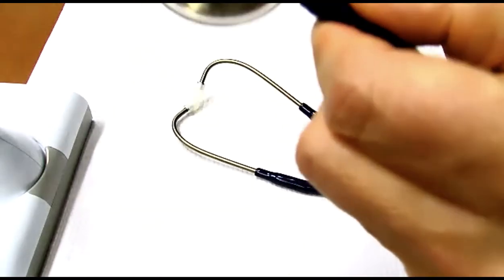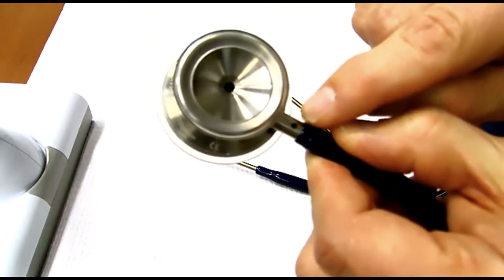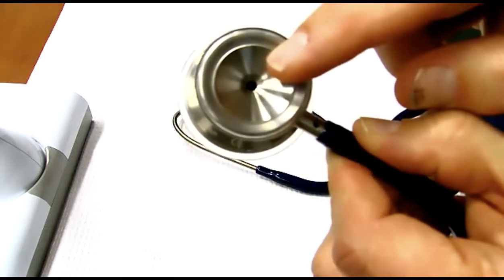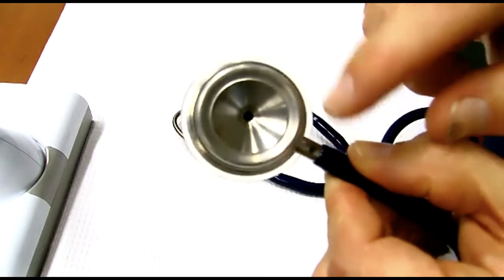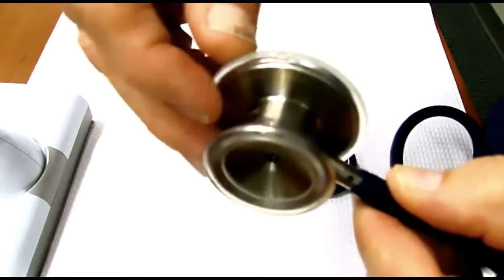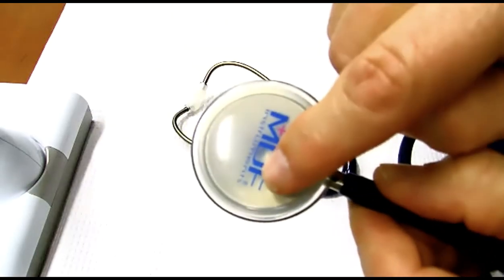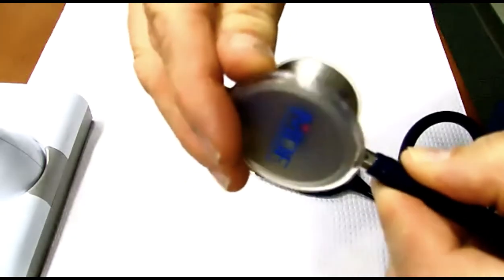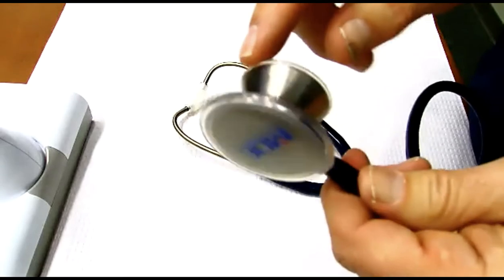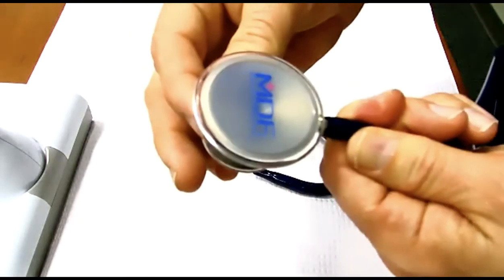Turn it around, look at your stethoscope until you can see a dot. There should be one; mine's a green dot right here. The green dot on the base lines up with whatever side is active. So since my green dot is right here, that means the bell is active. Watch this. If I want to use the diaphragm, all I have to do is twist. See the head twists? And now it's a little harder to see, but the dot is underneath the diaphragm. Okay, so now if I turn it again, then I've lined up the bell with the dot. So remember, to get it to work, you need to line up the dot with whichever side you want to use.